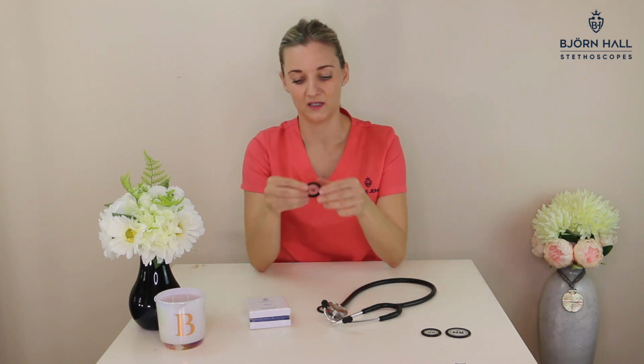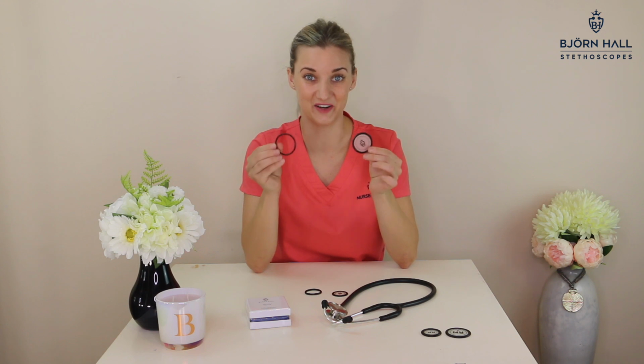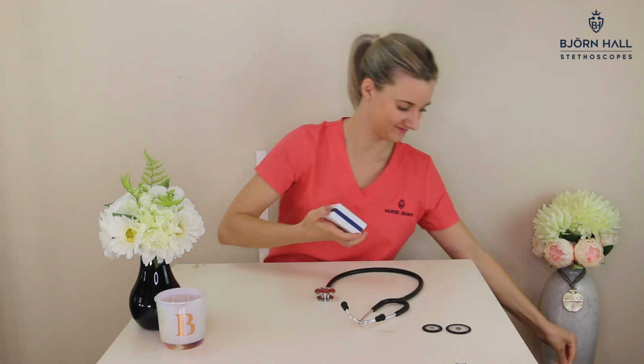Now don't be alarmed if the diaphragm comes off in 2 pieces like this. They are actually designed to do so, and I will show you how to put them back together later on. Now let's open the box with your new diaphragms in it.